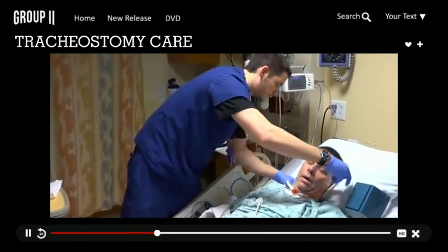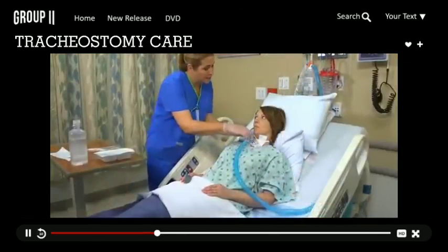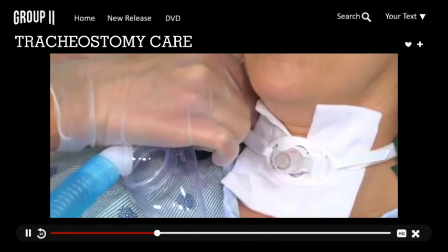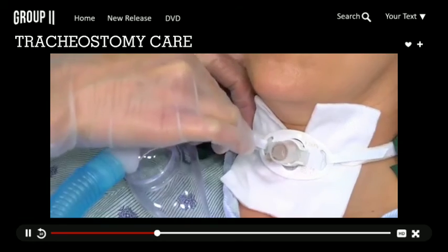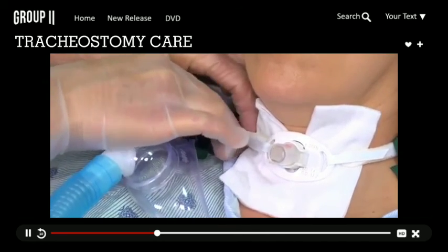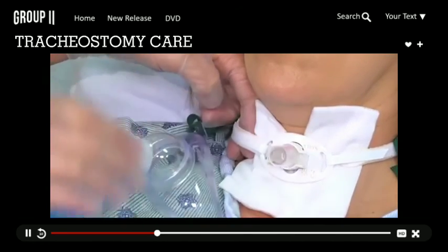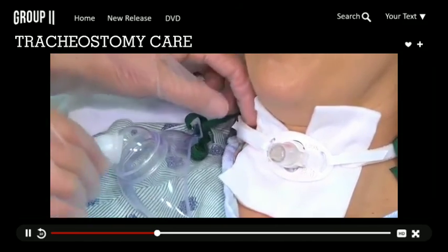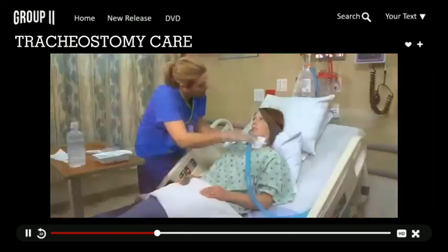Yeah. Okay. I'm going to check your tracheostomy ties. Verify that the neck strap has only enough slack for 2 fingers to fit snugly beneath it, or for 1 to fit loosely. Does that feel okay? Are you comfortable?